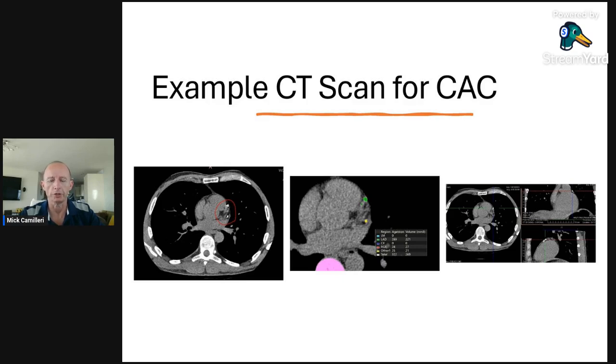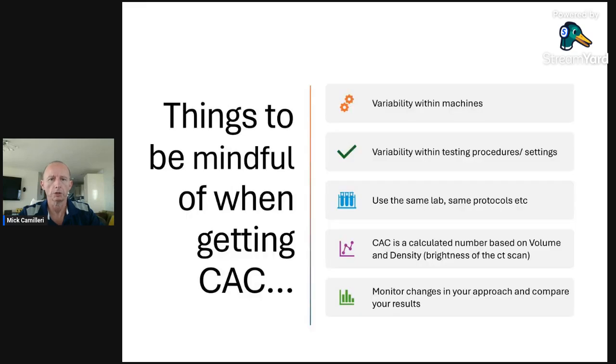Obviously, the accuracy of the image is what's important, and there are many factors that still can influence the quality of that image. The pixelation, if your heart rate's a bit too high, it could actually give you a blurrier picture than if it's a lot more stabilized, and below 70 is what they're targeting.